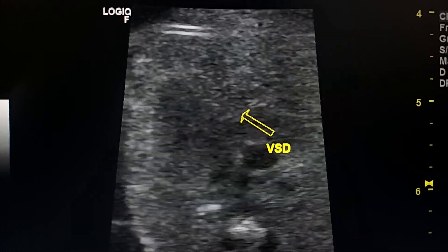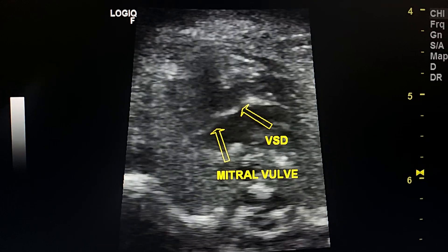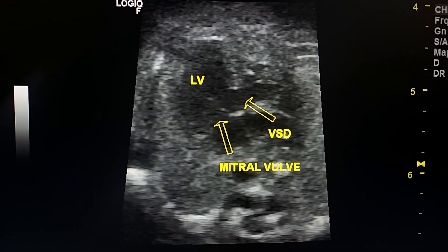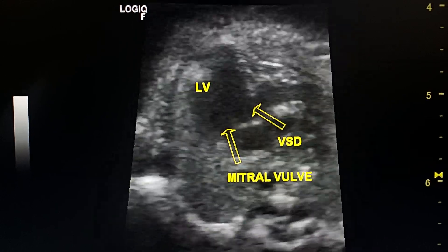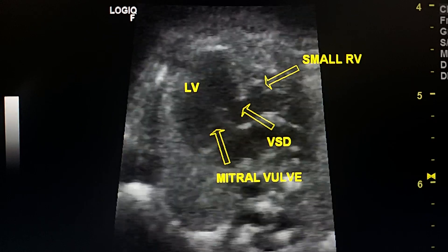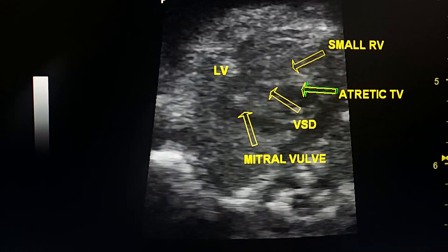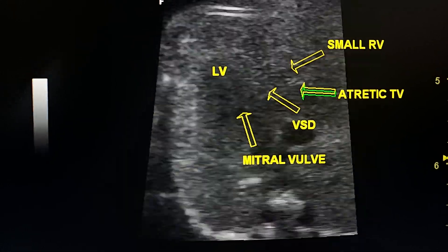This is the VSD. The mitral valve is normal. The left ventricle is normal. This is the small right ventricle. The atretic tricuspid valve is the echogenic band here.